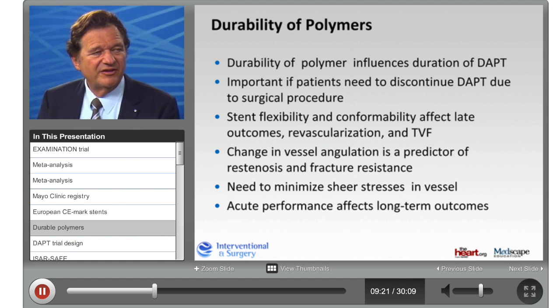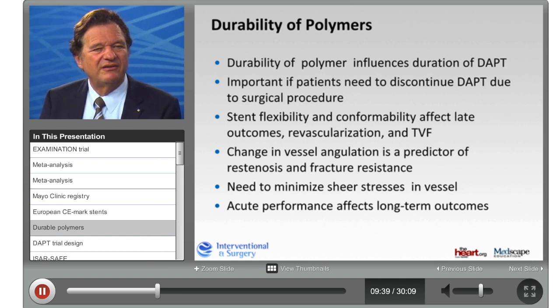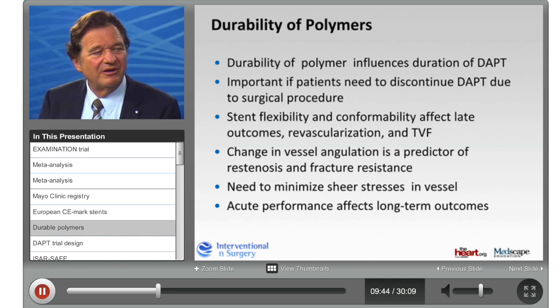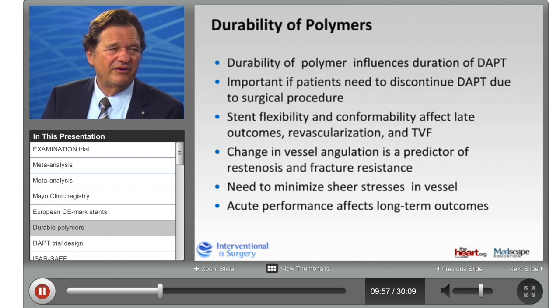That would be fantastic, because right now the European guidelines say still 6 months. There was a lot of data showing at least 6 months. The Americans say at least 1 year, although I think there's no data to justify this at least 1 year rule. So I think what we need is not only more efficiency in newer drug-eluting stents. It's hard probably to meet the big top drug-eluting stents regarding efficiency. Well, you can always do better, but I think what we do need now is not only, if possible, more efficiency. We need more safety with a shortened duration of antiplatelet therapy.